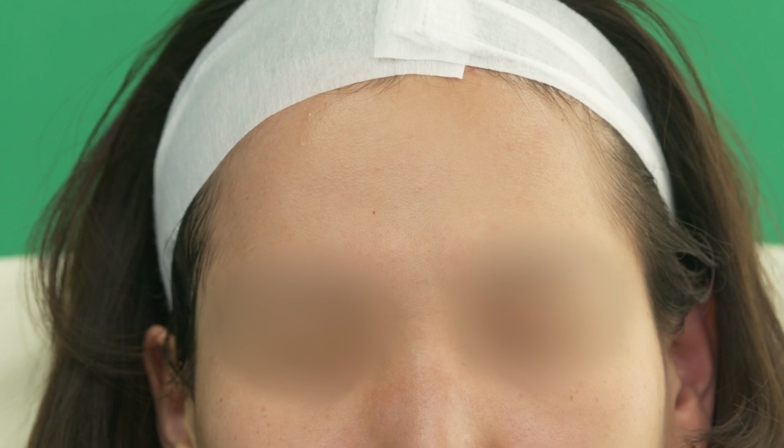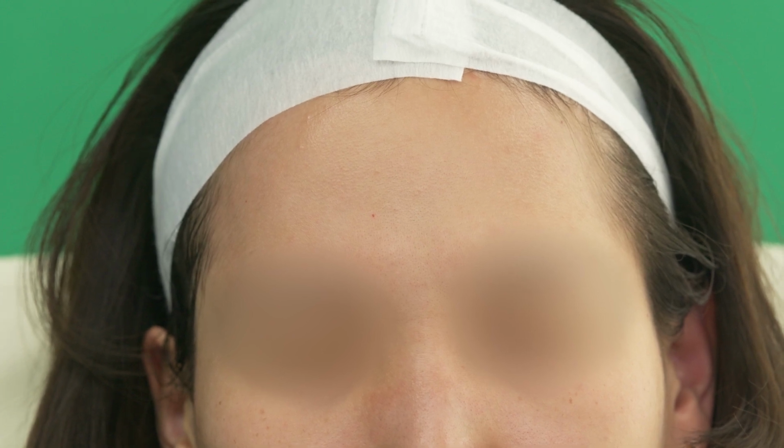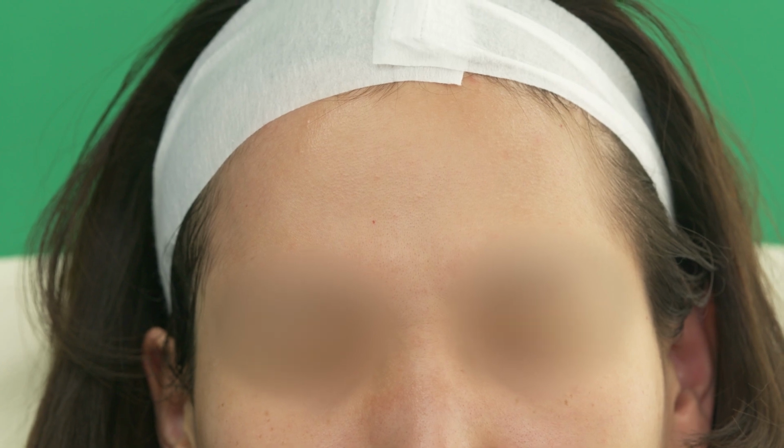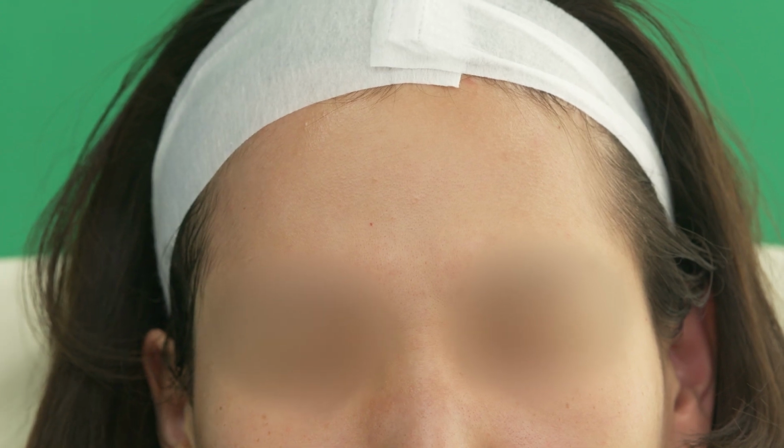If we accidentally inject some product into this artery, severe consequences such as skin necrosis, cutaneous granuloma, or even blindness can arise. But don't worry, with the aid of SONO-Finder, you can avoid the vessel and get the best outcomes.